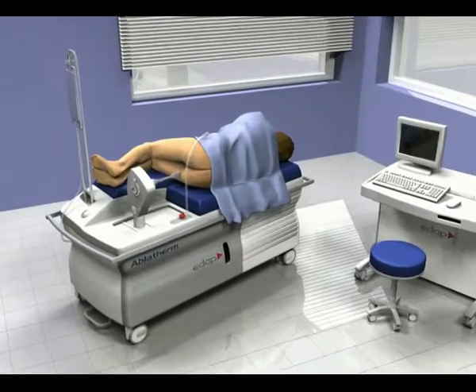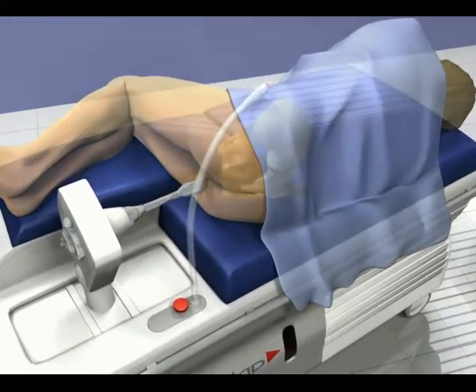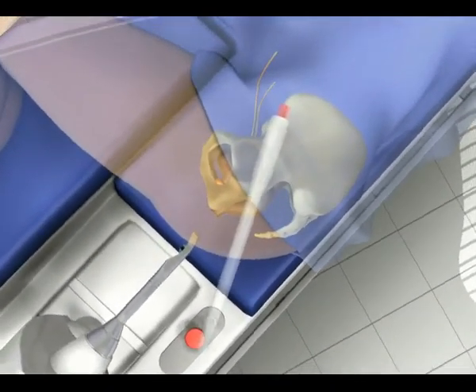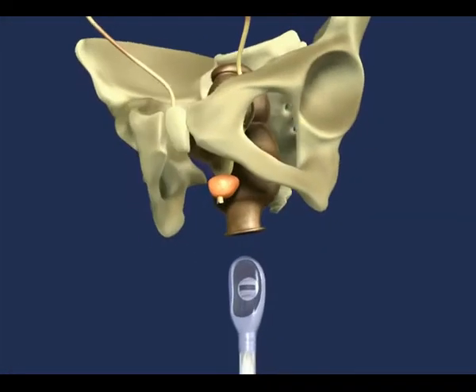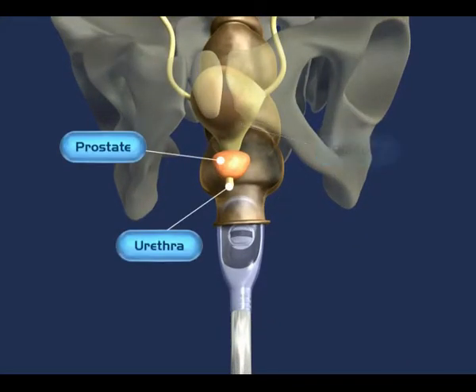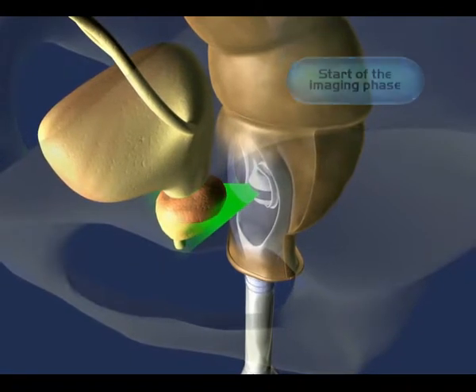After local or general anesthetic is administered, the patient lies down on his right-hand side and stays in that position throughout the treatment. The probe is lubricated and then inserted into the rectum via the anus. This non-invasive position enables the probe to be positioned facing the prostate, which is then accessible for ultrasound imaging and treatment.